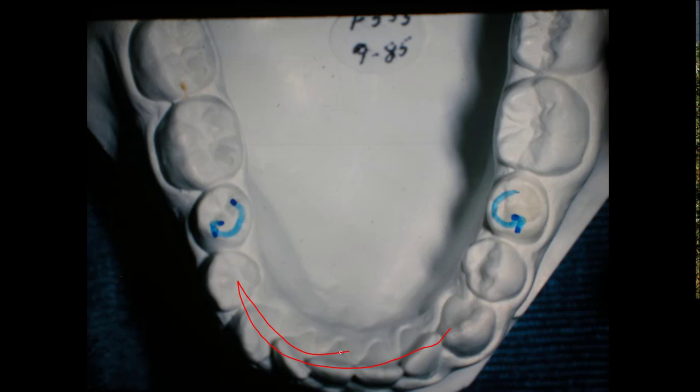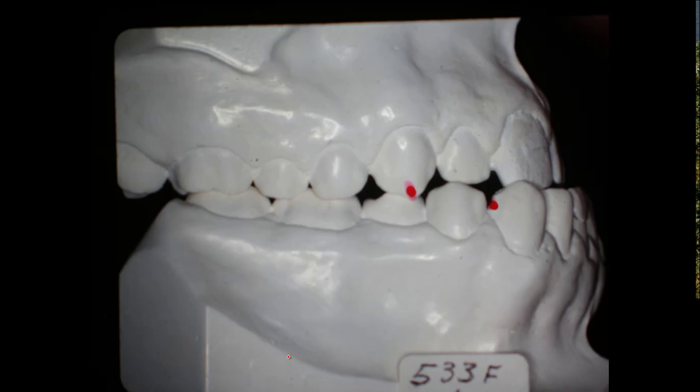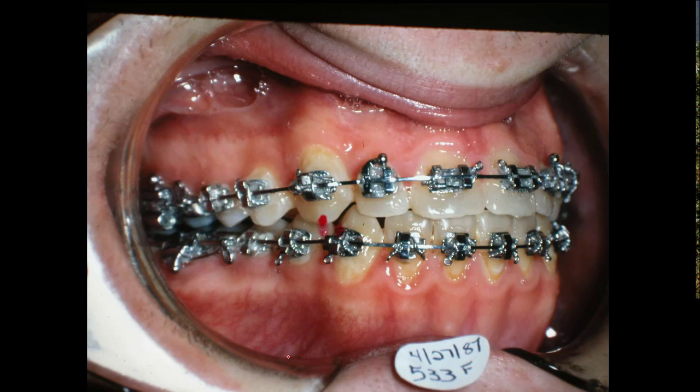So really the lower jaw needed to come a lot further forward. By the time we fixed it for the surgeon, we brought it all the way out and lined it up, and then the surgeon would work on it. But he sent him back to us. Everything was fixed up and lined up good. And you see where it was to start with, and you can see where the surgery brought it.